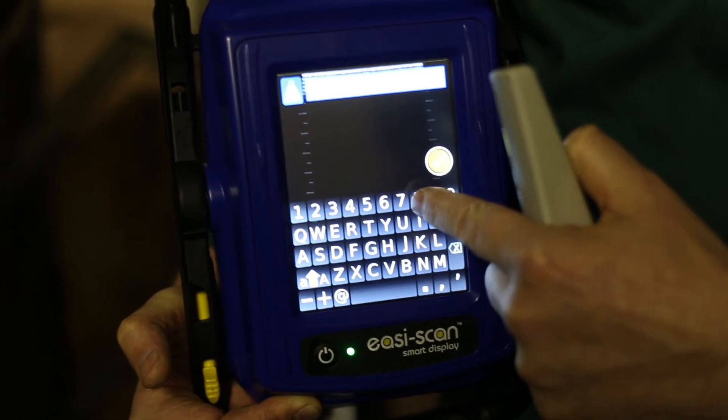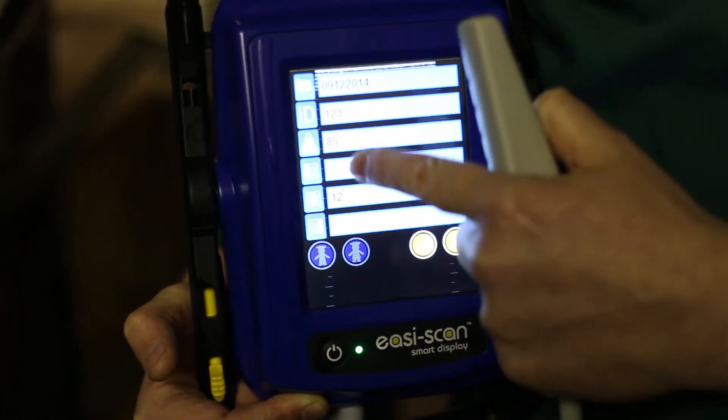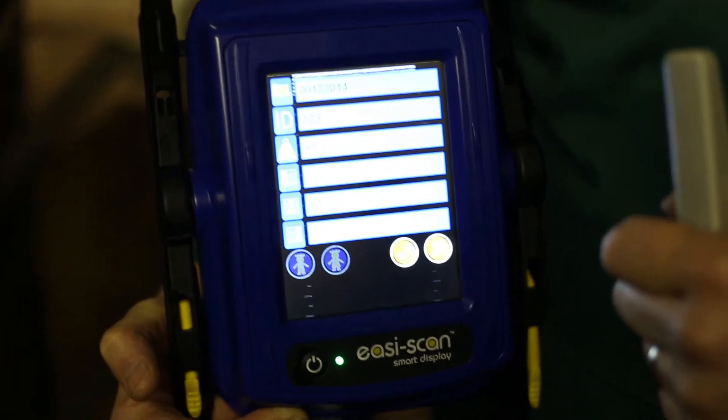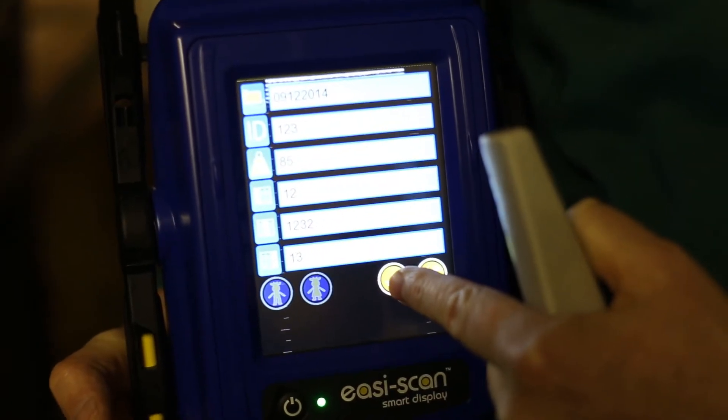Enter the weight of the animal and press save. These three fields represent the areas that you can populate for back fat, for loin, and for shoulder measurement, and then press the save button.